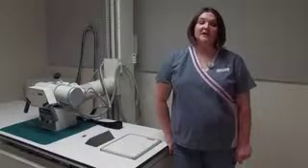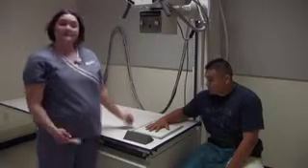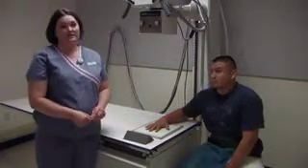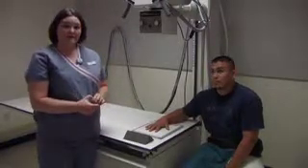If this had been a female patient, you need to make sure to ask if there's any possibility of pregnancy. We already have shielded our patient before we started filming. So that's your right hand. Again, you verify that with your requisition, ensuring that it is the proper part. We want to do a PA, oblique, and lateral projection.